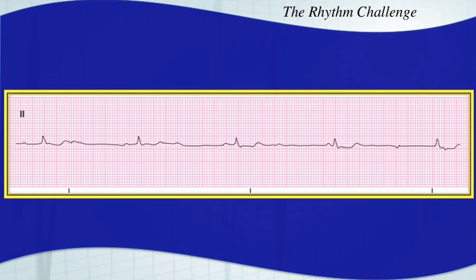This is a 3rd degree AV block. It shouldn't be that difficult to identify these P waves throughout with no association with the QRS complexes. 3rd degree AV block.